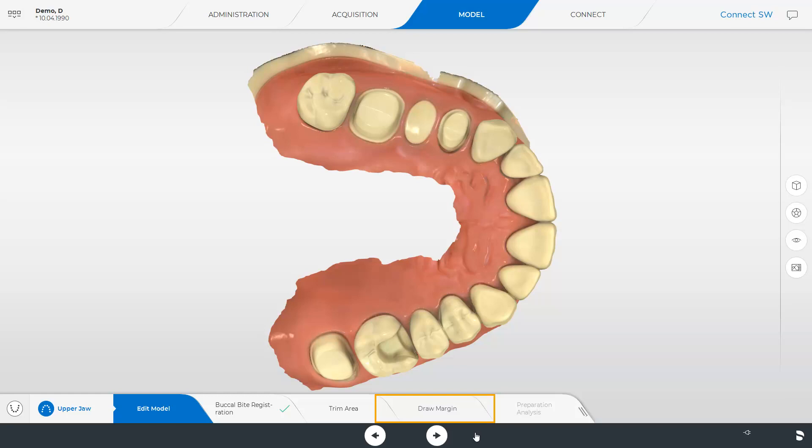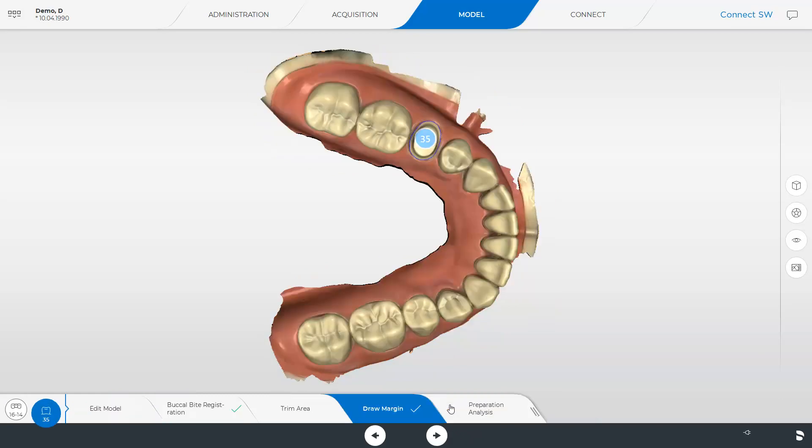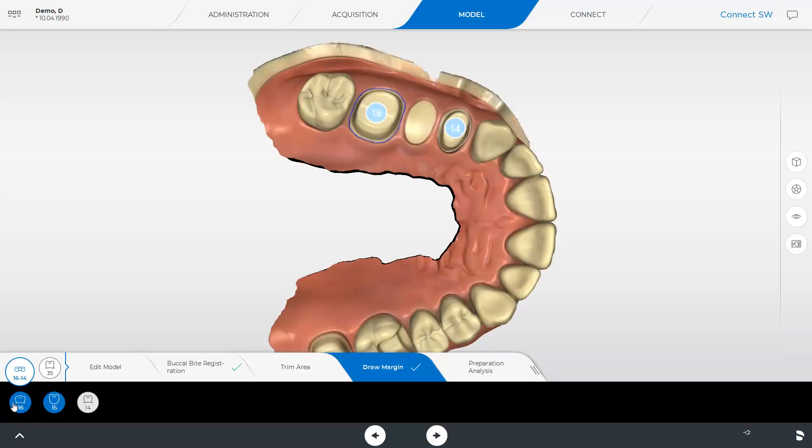We tap the step draw margin and then you will see the models with already predefined margins. To view the margins of the bridge as well, we will click the corresponding button on the left edge of the screen. At this point, we will finish the model phase and continue with the last phase, Connect.